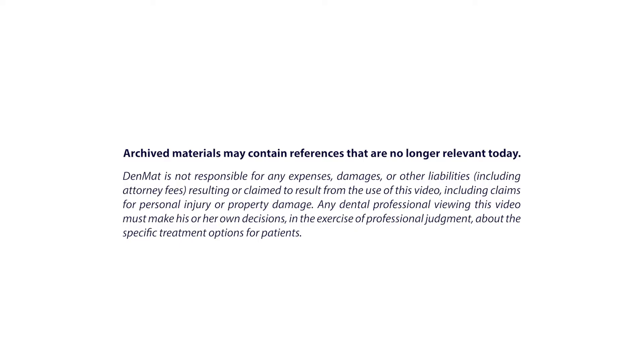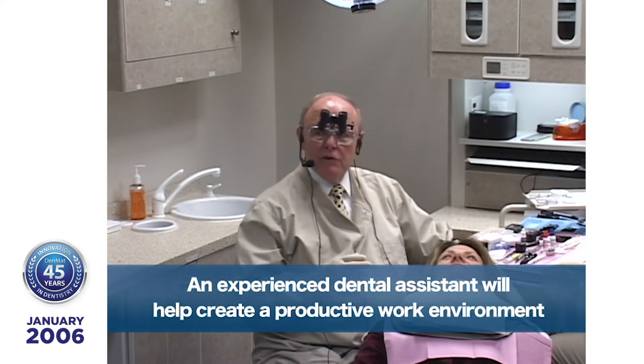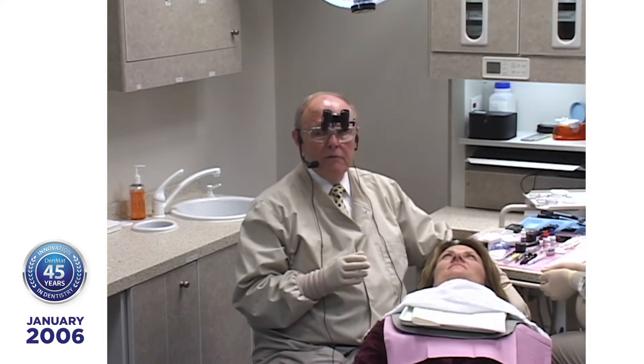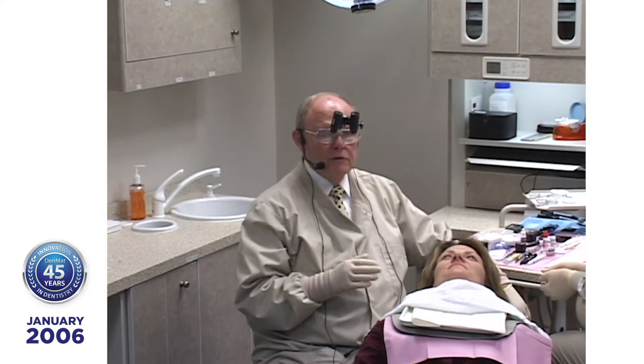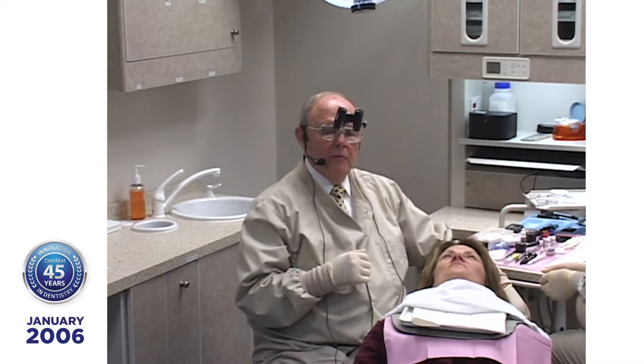Today we're just going to be working on natural teeth. Let's talk a little bit about getting ready to do this, because in many ways this will seem maybe too simple. It's going to be because I have my dental assistant — she makes it simple. When I walk in, everything is done for me ahead of time. So be sure you have your staff trained.